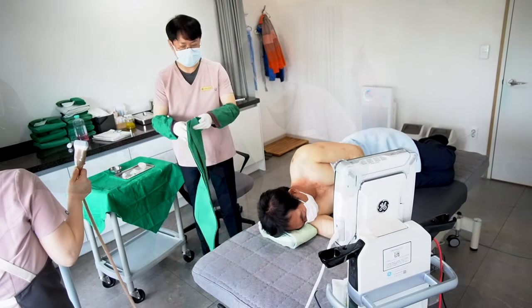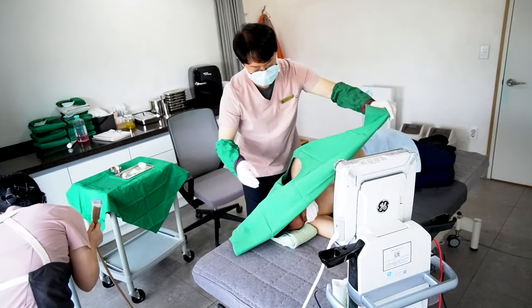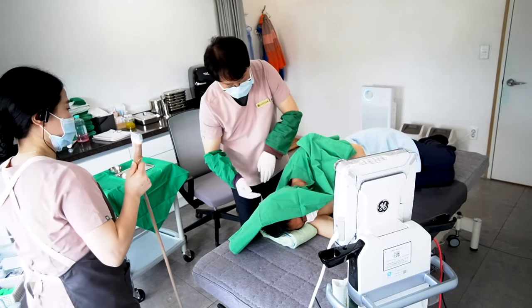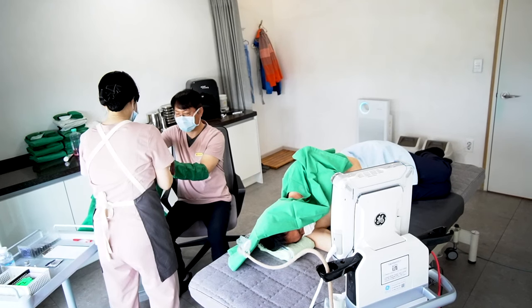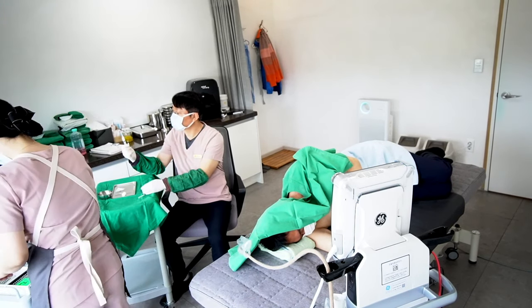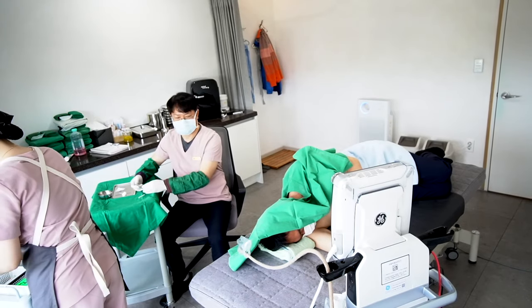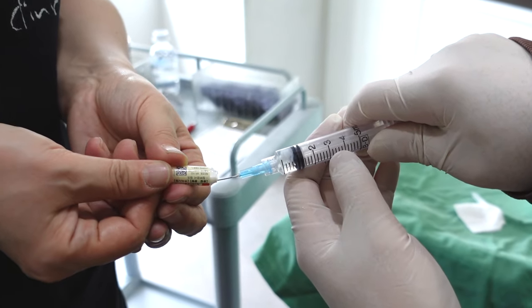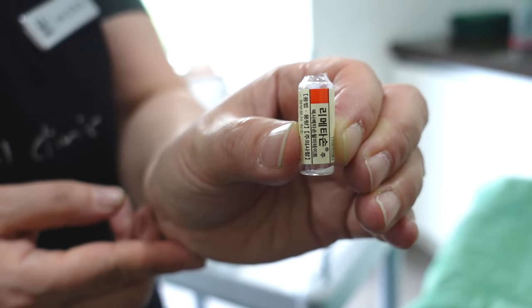I try not to cover the patient's whole face, as some patients feel highly anxious. Don't get me wrong — I do not use particulate steroid. I always use a lipid form of dexamethasone, which is why the liquid looks white.